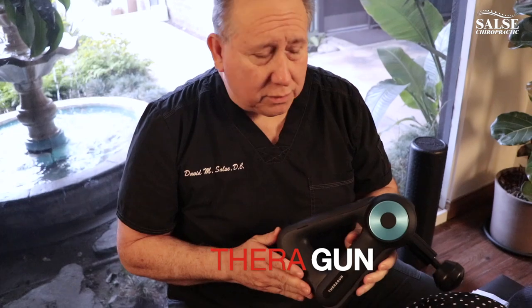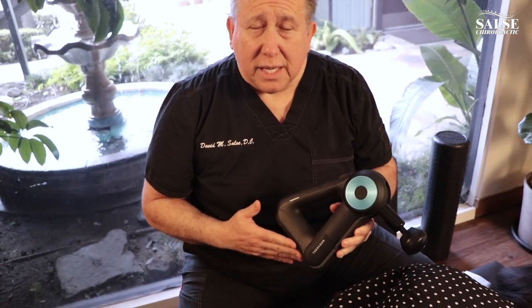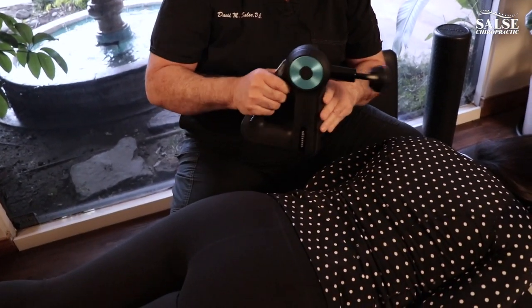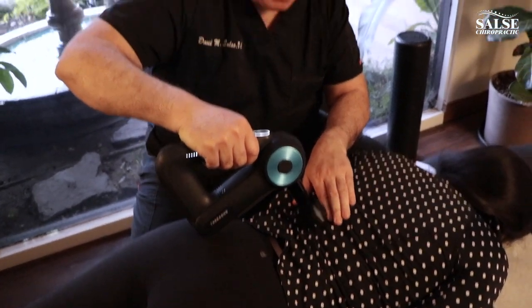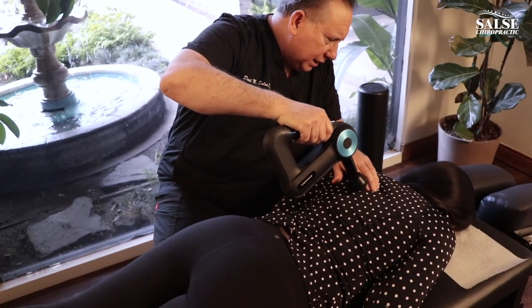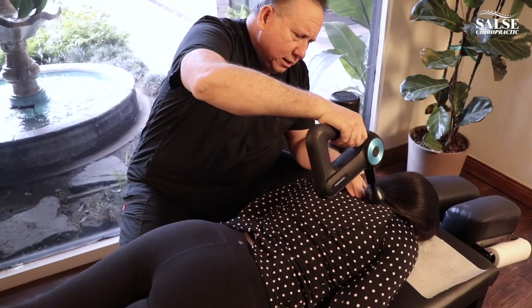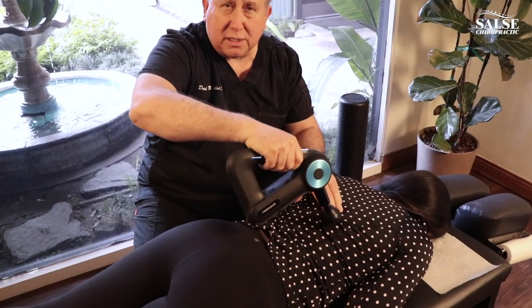This here is the Theragun, and this is a great tool that we use to help release the tension and tightness of the muscles, and we're going to use that on Rachel right now. Again, we're working with the paraspinal muscles. Can you handle that up there Rachel? You notice I stay off of the bone, off of the spine — just in the muscle.